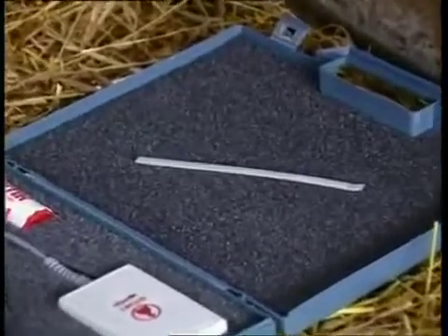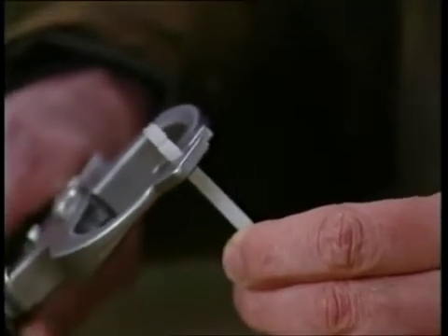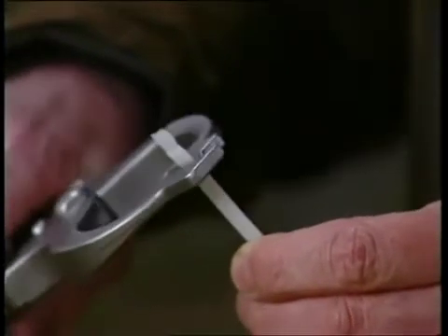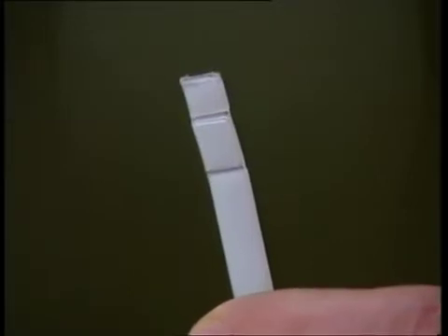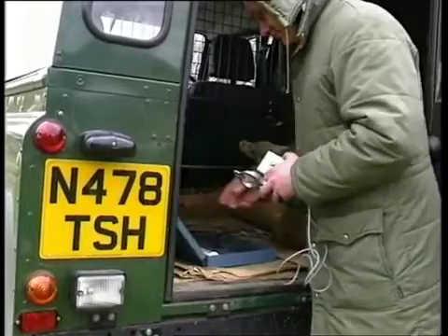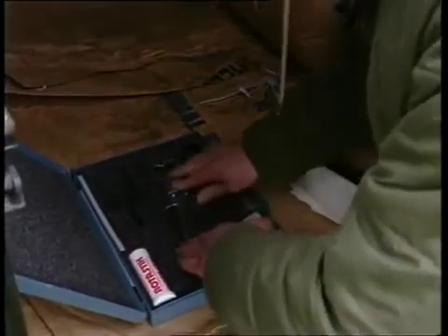In order to check whether the nipper is applying the correct pressure, a standard nylon strip with the standard indentation is supplied with each emasculator. If the emasculator is applying too much pressure, it will cut the strip; too little, and the indentation will be far less marked. Always check the emasculator before each season's use. After the job is finished, cleaning and correct storage are both important. Bloodless emasculators should not be stored closed or in damp conditions, as this may result in failures or injure the lambs when next used.